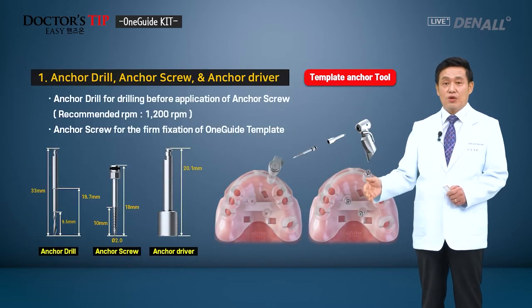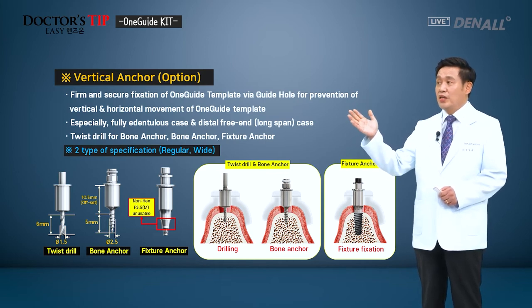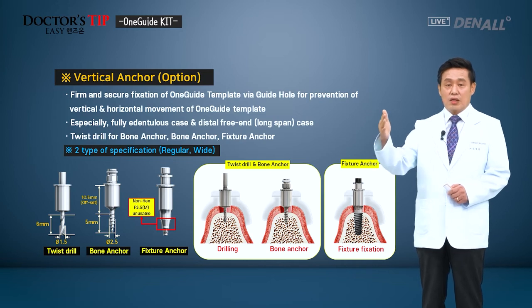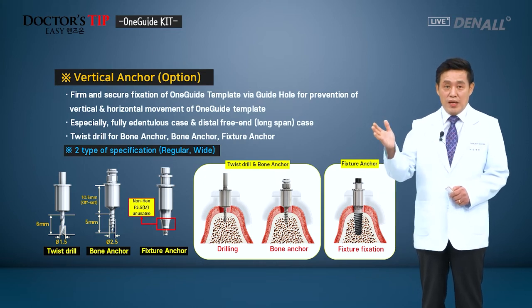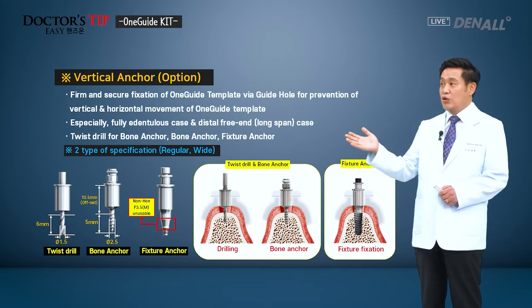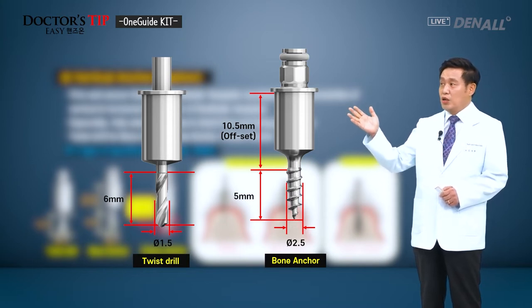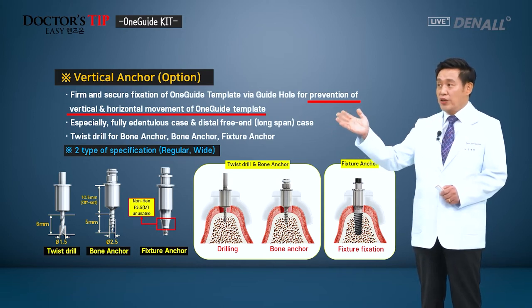There's a lateral anchor system. Another option is the vertical anchor system. In other words, with the lateral anchor system, at times the palatal or buccal gingival thickness or other factors may cause deviations. So on the computer, you cannot get the fixture position you had virtually planned. In order to prevent this, using a vertical twisted drill and bone anchor, you can prevent vertical and horizontal movement of the OneGuide template. This is the vertical anchor system.